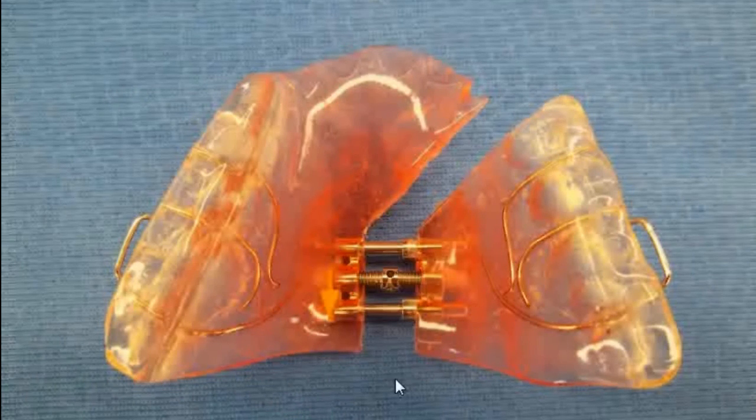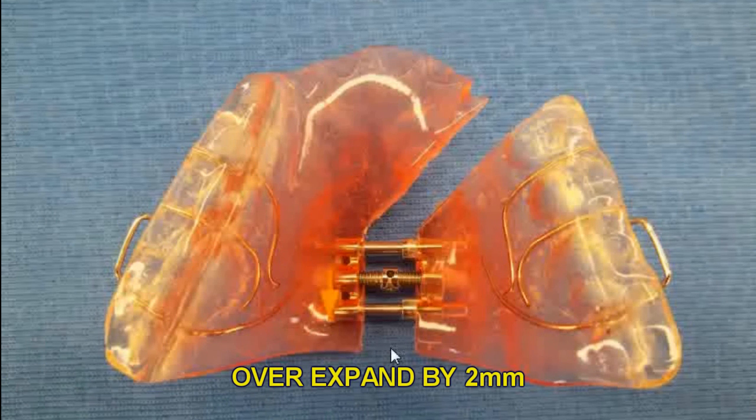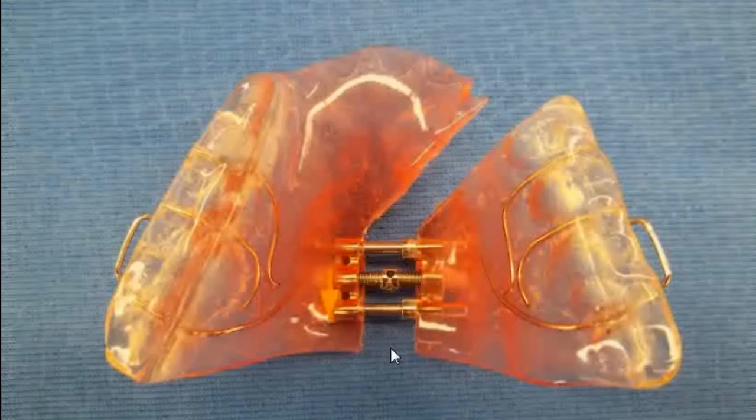The screw for the Nord appliance is an 8mm screw. You want to have your patient turn it one turn twice a week. It's very important to overexpand the crossbite by at least 2mm. These types of crossbites have a strong relapse tendency. Because of this tendency, long-term retention is very important.